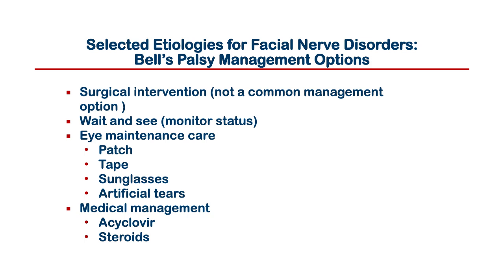It's very uncommon for surgical intervention to be necessary, but it is an option. If the inflammation is clearly destroying the nerve, if there's total degeneration of the nerve, as we record it outside the stylomastoid foramen with ENoG, and that is total degeneration and it's not changing, very often an otologist will operate. Basically what they're doing is trying to expose the facial nerve inside the temporal bone and drill off enough bone where the nerve is not being compressed.